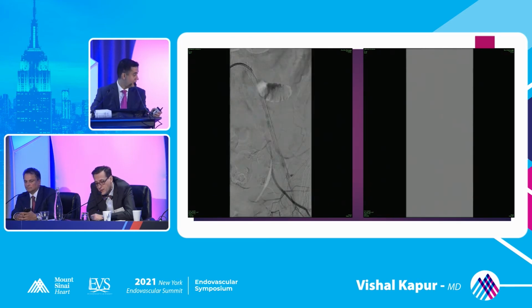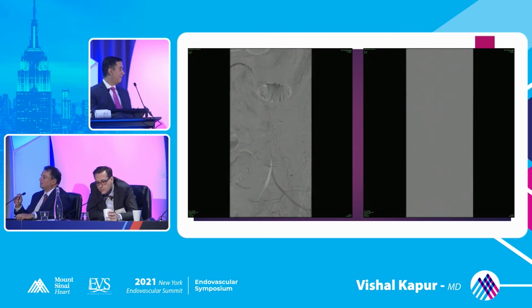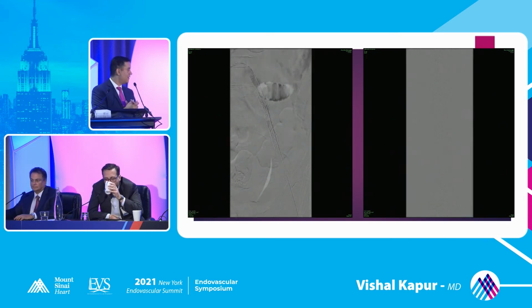But everything went very well. And again, there's a little bit of a stenosis right after the problem, and I think that's when the covered stent got stuck. So somehow it got perfectly placed. Nice case. That's a great result. Very good. Great case. These covered stents are notorious for coming off the balloon. Horrible. If you can deliver them through your sheath, you're better off. But in this case, you couldn't.